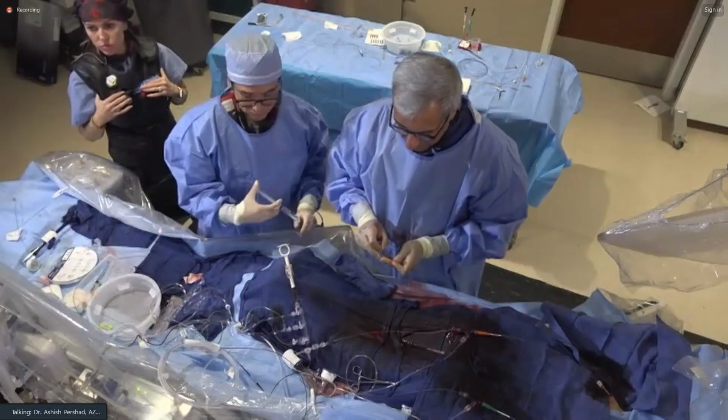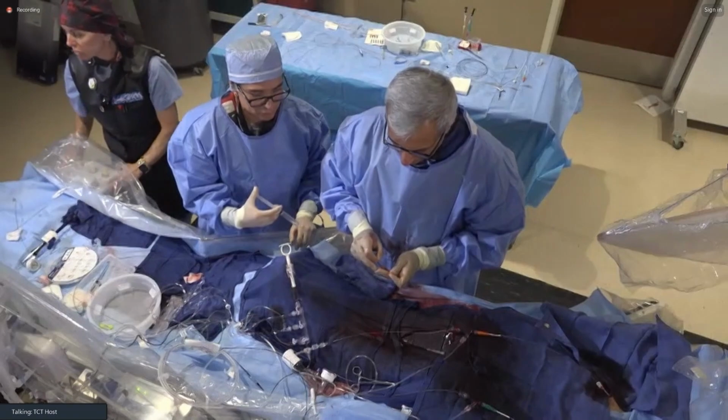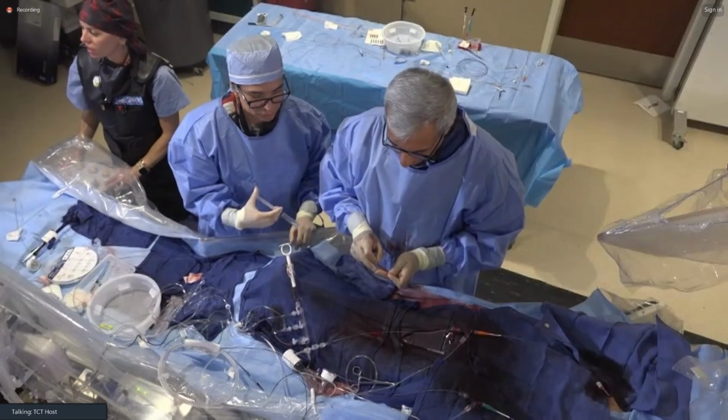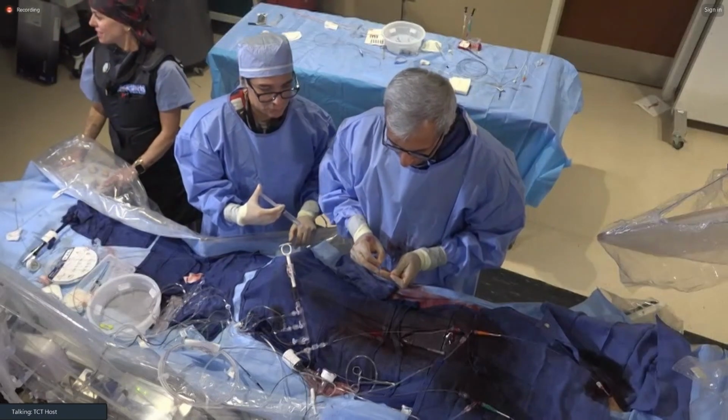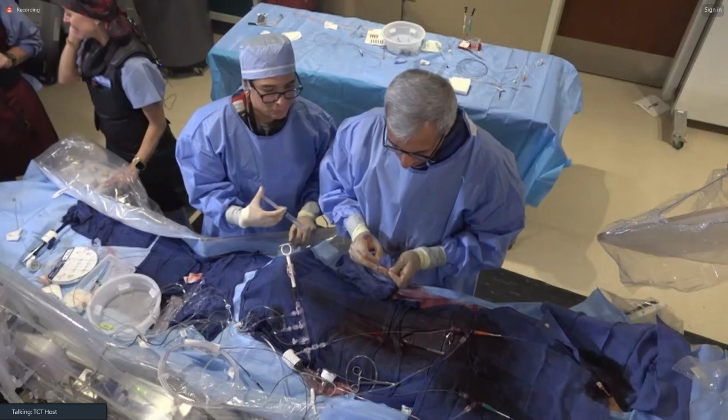And get that stent for a particular distal question. If you're in doubt whether it's a dissection, whether it's a hematoma, etc., I mean, we were just talking about it. The easiest thing, you already have an IVUS catheter. Just look. Put it down, take a look. Confirm 100% before you decide on your strategy. You're going to have to IVUS those stents anyway, right? So you're not losing time.